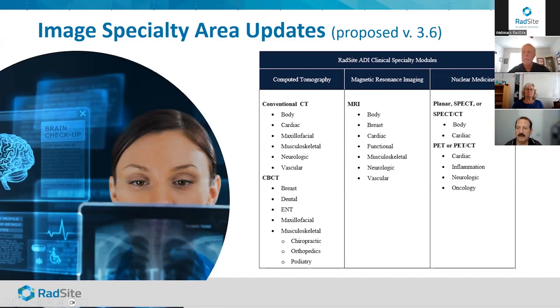Great. Eliot, one of the things we've started doing on the physics side is we've purchased a commercial phantom for image quality, and we've started collecting data on different CBCT vendors to see how tight we can create the standards from one vendor to the other, have a uniform standard set, like you're saying. Yeah. But we're in the data collection phase right now.